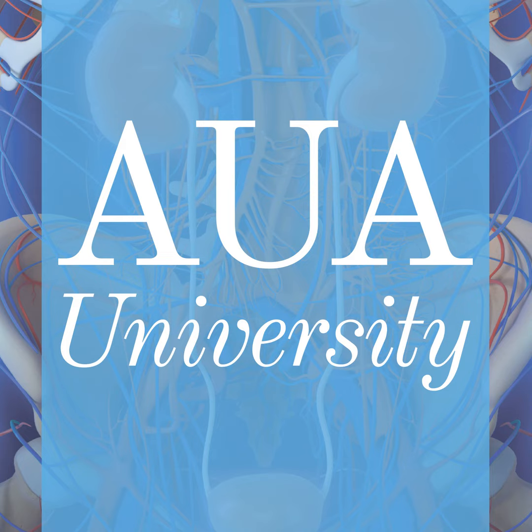It might result in false negative results if you have small locally recurrent deposits, which are then hidden by the bladder, for example, if it's filled with urine and you have all this gallium PSMA in the bladder. There should be a 60-minute interval between the injection and the imaging. At first, nuclear medicine people usually get a plain CT scan from the skull to the lower extremities. Thereafter, you have your PET images, and then you do the fusion of the images.